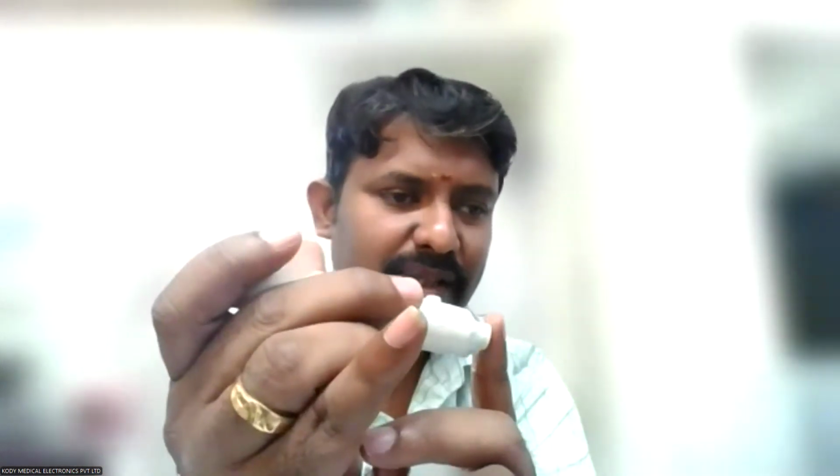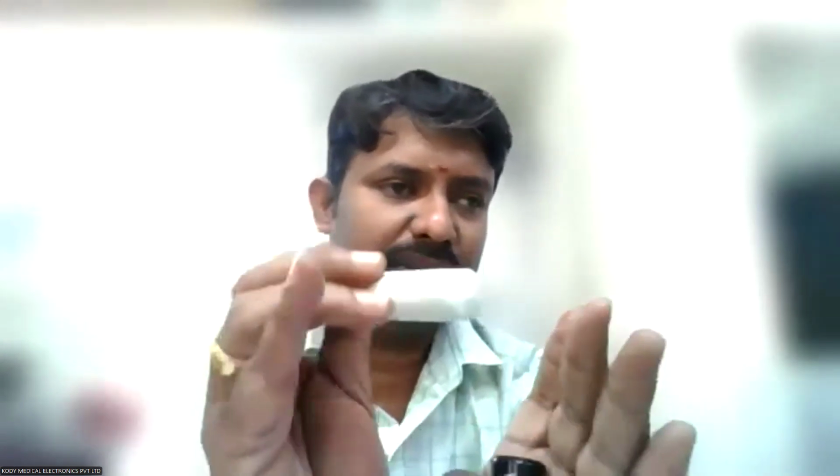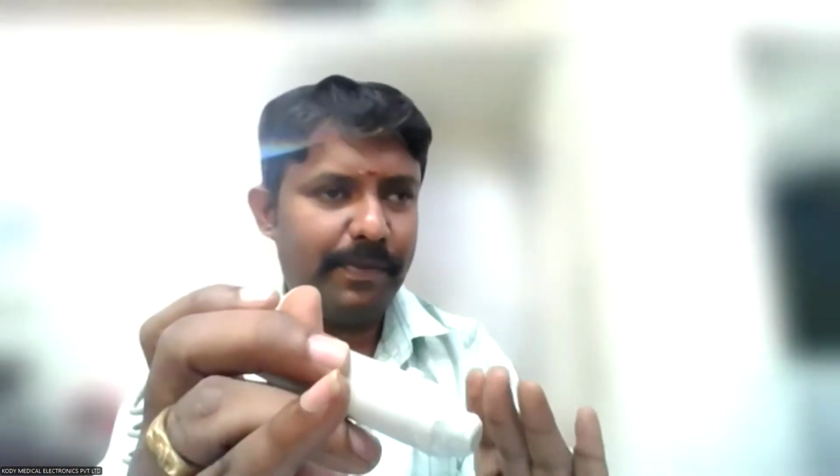You have to squeeze gently, then it will capture the flow. The depth of penetration of ultrasound lies in the range of 0 to 10 mm only. It won't go beyond that. Within 10 mm, even if it is inside the bone, it will capture. No problem. Inside bone, you can capture? Yes, sir, no problem.